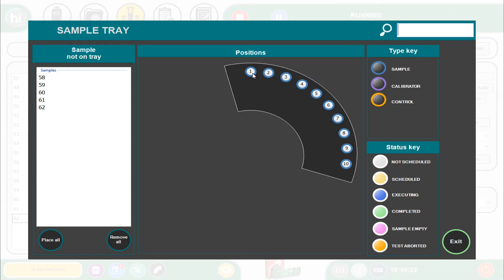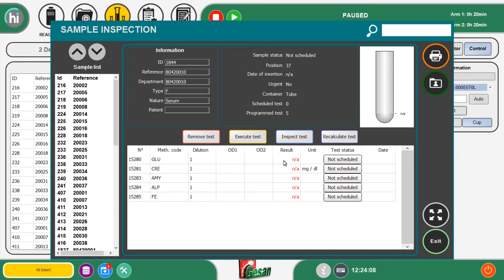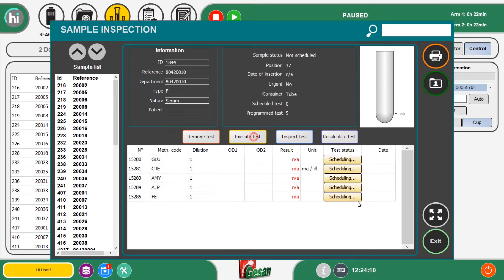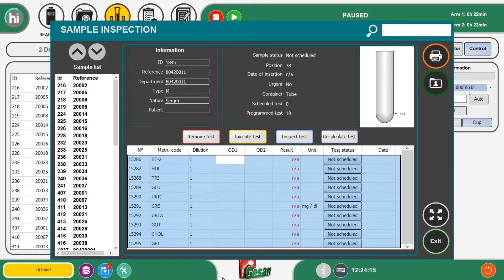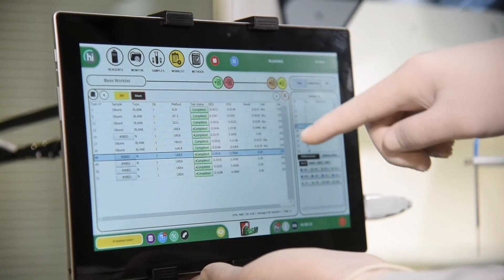The details of the samples on board can be shown on screen, confirming and starting the execution of the available samples with a simple and intuitive interface.